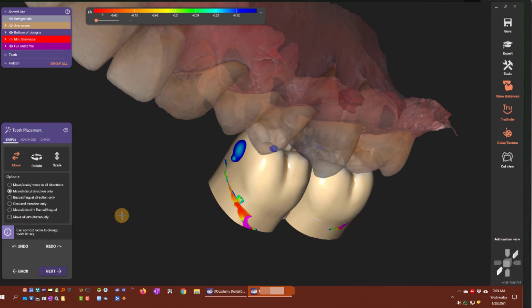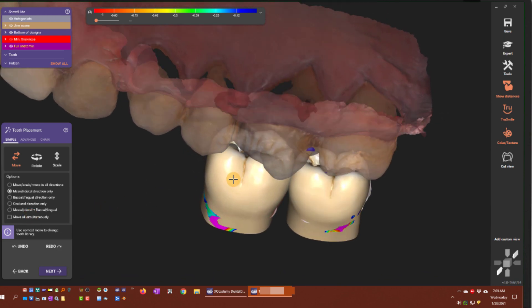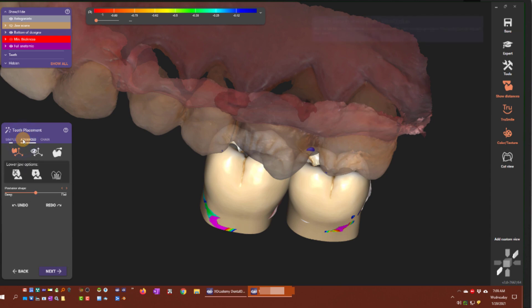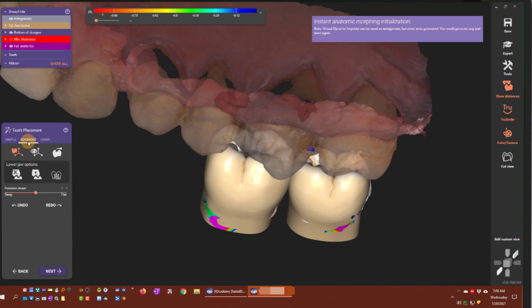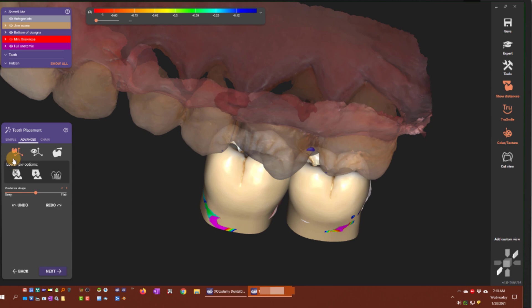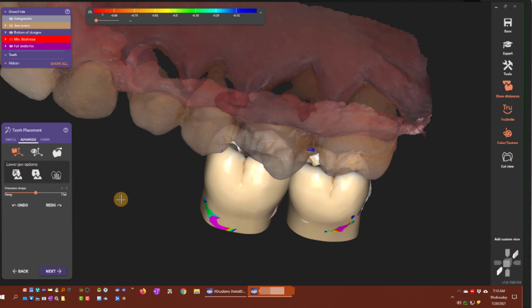What's new — an added functionality for this version — is if you go to the advanced menu in the tooth placement step, you'll see we have these six icons, three on the top and three on the bottom. And then you have a slider that says 'posterior shape: deep or flat.' This is the instant anatomic morphing tool, even if it doesn't say so. Let me show you what that does.